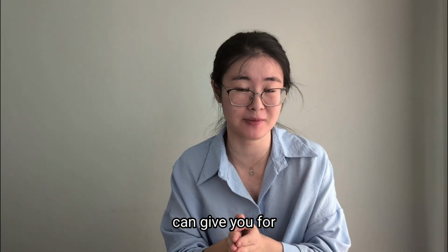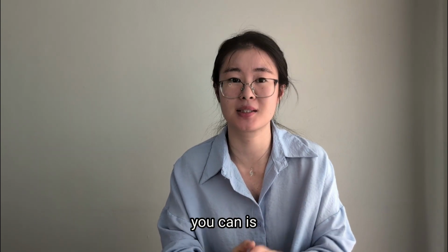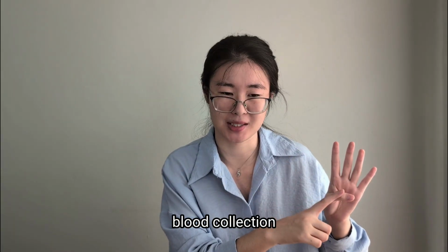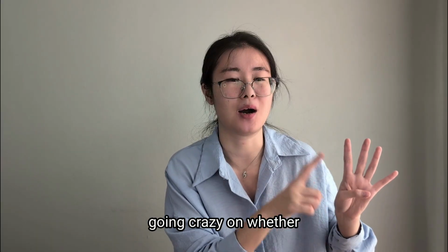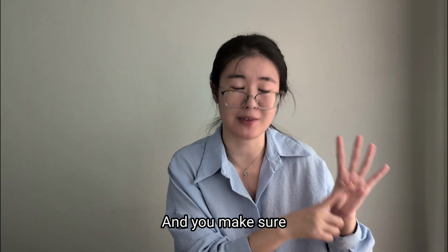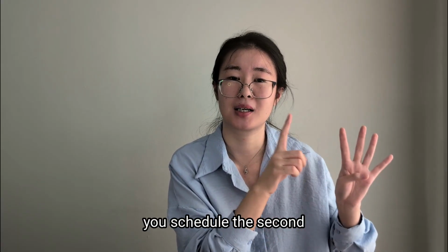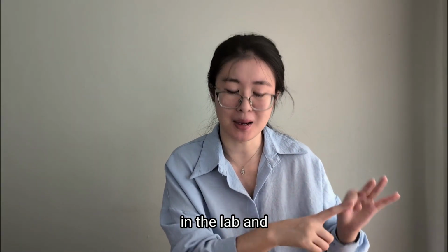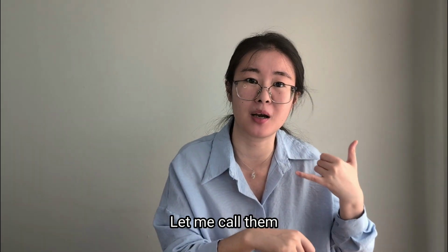The biggest tip I can give you for getting a result or a product from blood bank as fast as you can is, first, make sure there is nothing missing on your blood collection: your name, date, and time. Blood bank is especially strict about whether you are giving me the correct patient blood sample or not. And if your patient is brand new to our hospital system, you schedule the second collection for the confirmatory typing. Because blood bank is not going to wait in the lab and stare at their watch like, this is a new patient, they're supposed to give me a second blood, let me call them and tell them they need to do that.